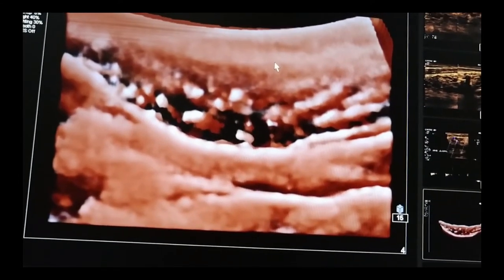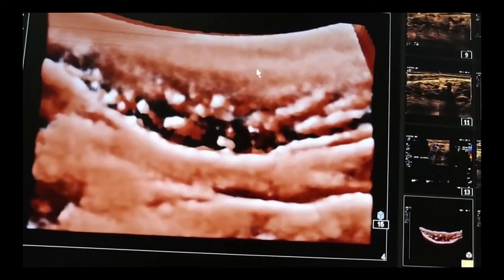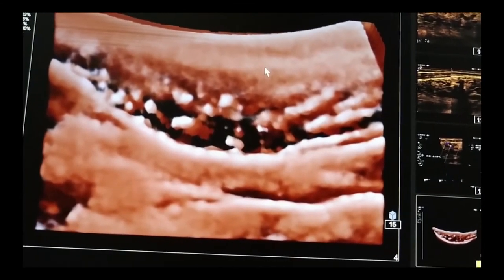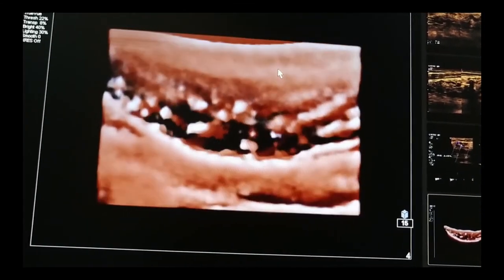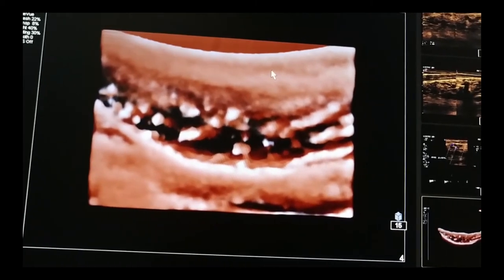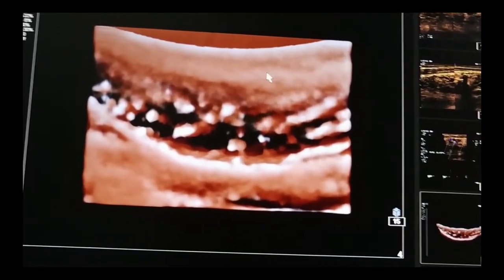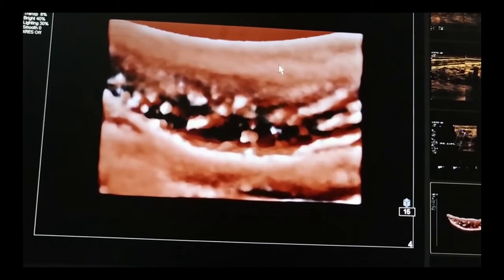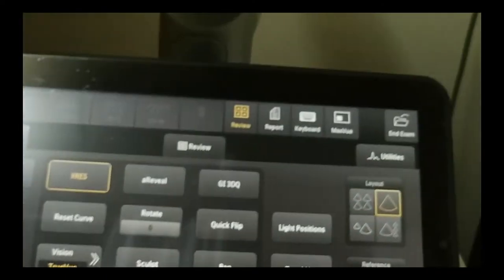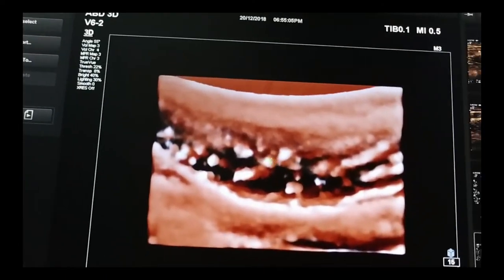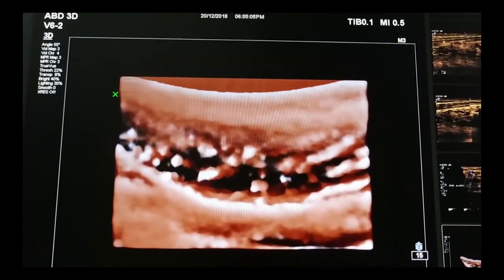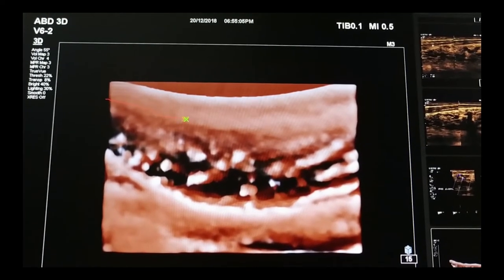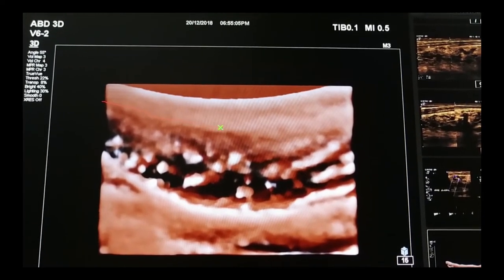Now I am zooming the image to fit the screen. Excess zoom in may cut your image borders, so be a little careful about that. Now I will cut the image by pressing the sculpt option. I will just keep the structure I want to see on the display.